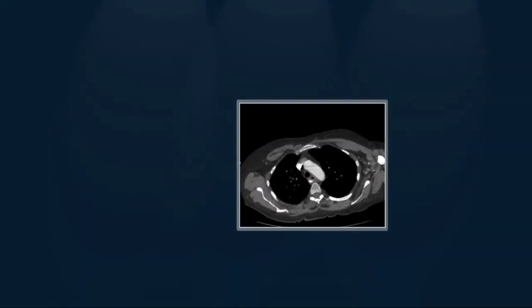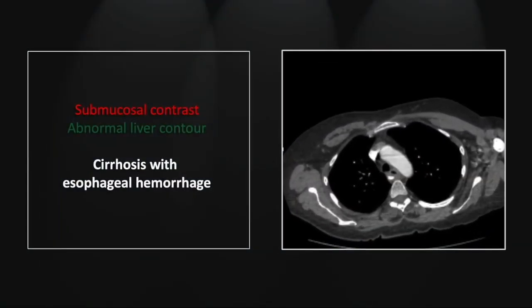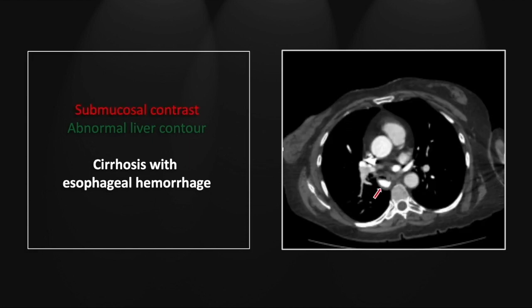Our next case is a case of cirrhosis with active esophageal hemorrhage. There are foci of submucosal contrast denoting active extravasation, possibly below the level of the mucosa, here in the upper esophagus and in the mid-portion as well.